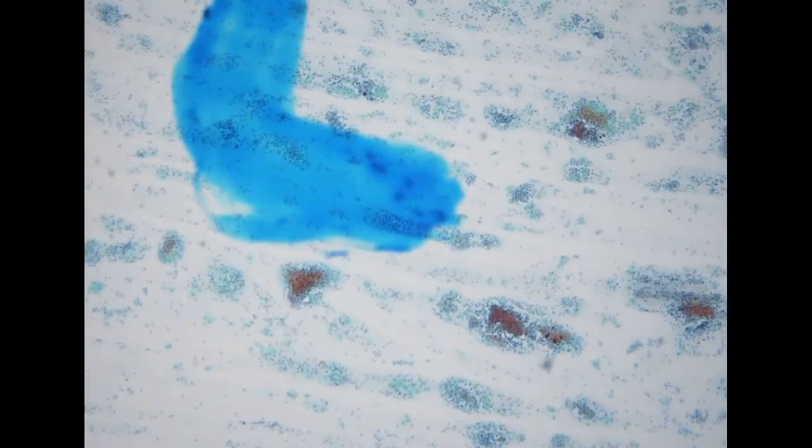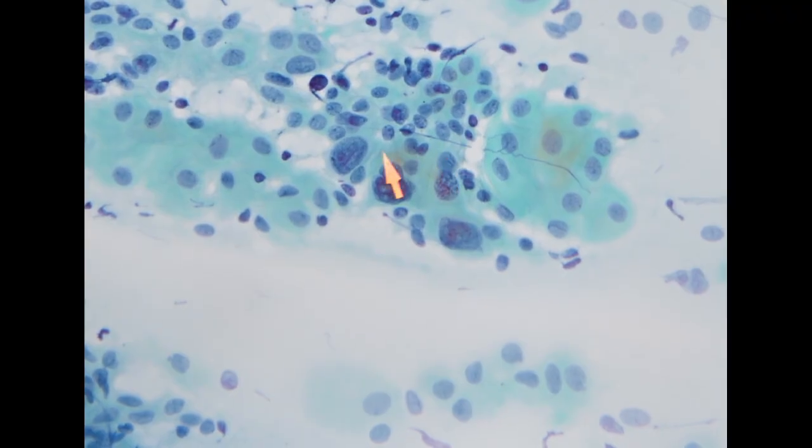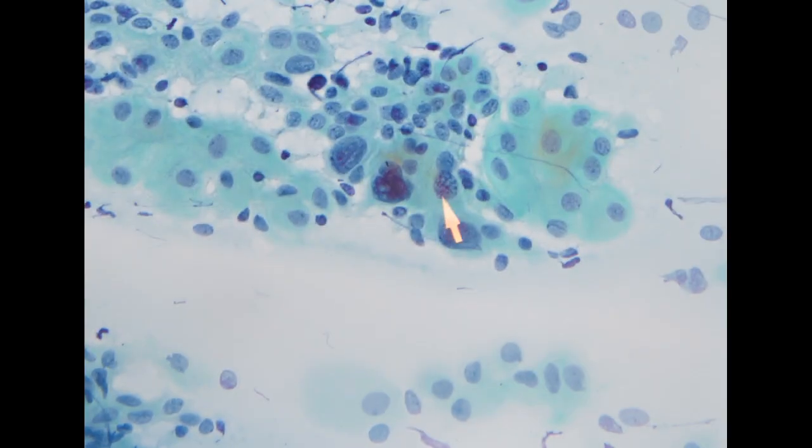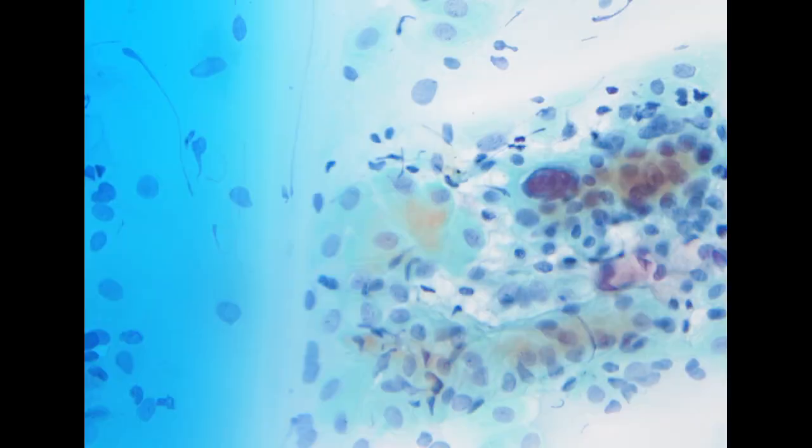So I think this is when we see a specimen of atrophy, if it only shows enlarged cells, but with a more smudged chromatin pattern, sometimes we won't be too worried about this. However, because in this specimen the enlarged cells are more prominent and the chromatin pattern is more hyperchromatic and coarse, I think it's reasonable to call it atypical squamous cells, and the clinician can make further evaluation for the condition. So we call this ASCUS.